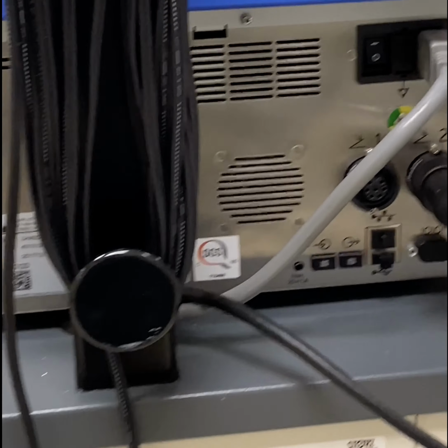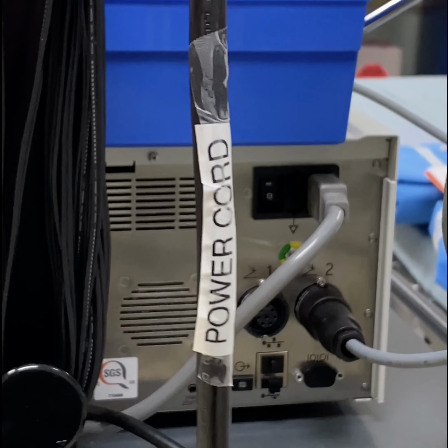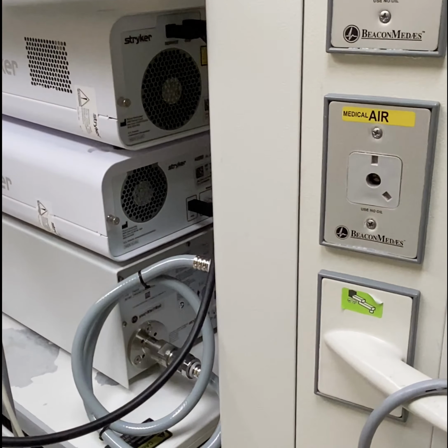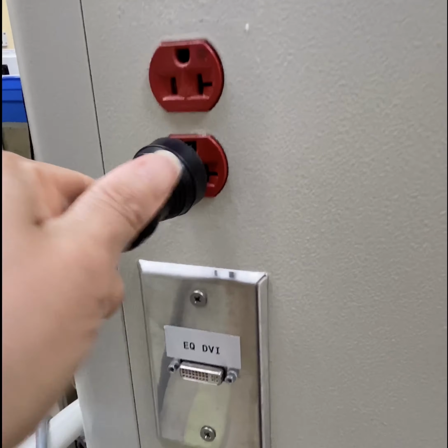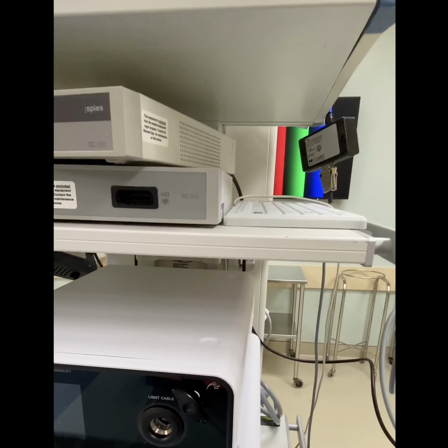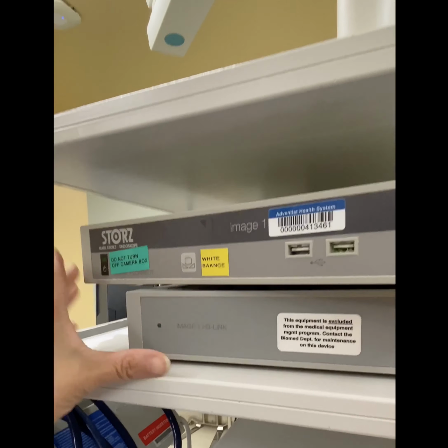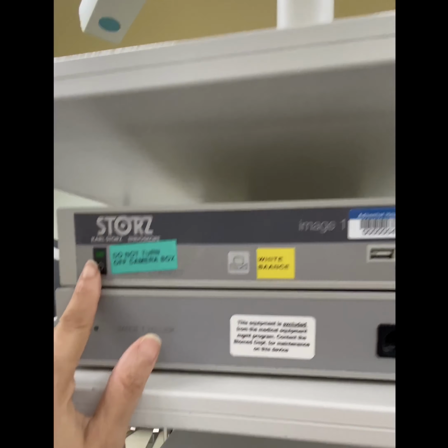So you're going to grab the power cord, which I labeled as best as I could, power cord. You can just plug it into the back of the boom or wherever you have a power source. Once you plug in the main power cord on the back of the blue light cart, you're going to come back to the front of your boom, go back to where it says Image 1, and turn it back on.